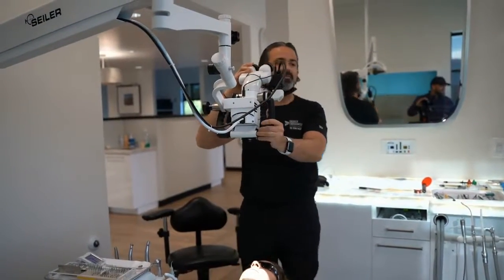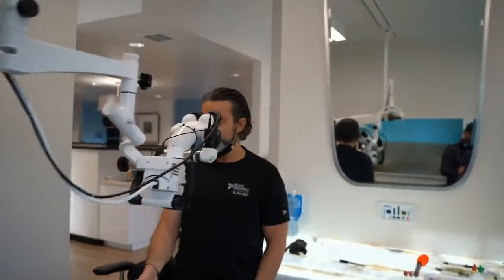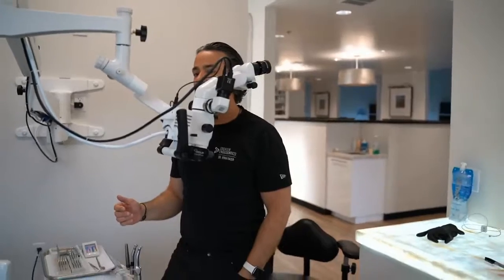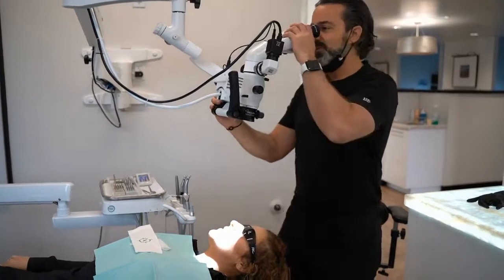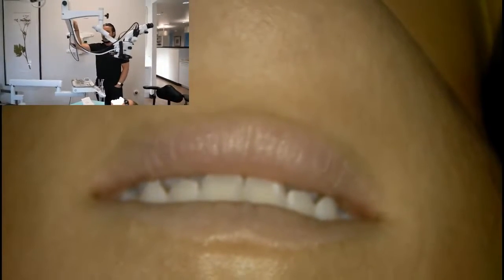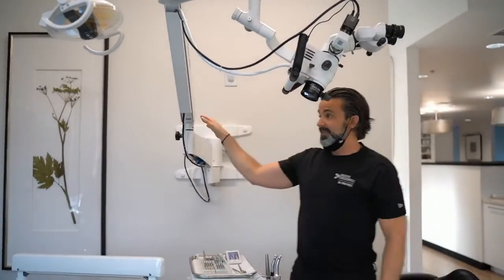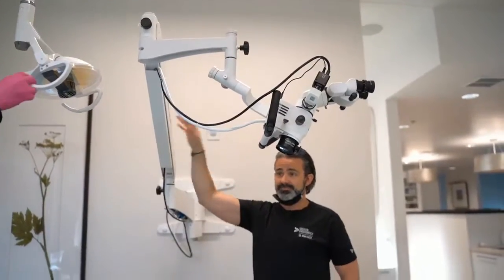if I were to stand up and try to do anesthetic, or I want to stand up, my patient's laying down, or if I move my chair up and bring her into focus just by moving the chair, and I want to use my microscope or anesthetic from standing up, this boom arm is fantastic because it gives me a ton of height. So we're not bumping heads, or if the patient wants to just jump up out of the chair and take a potty break, this longer boom, whether I'm standing or sitting, is really advantageous.